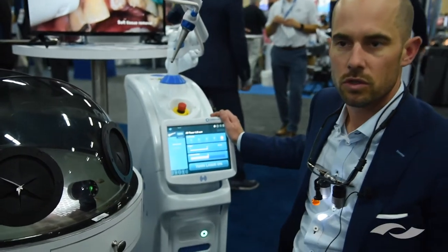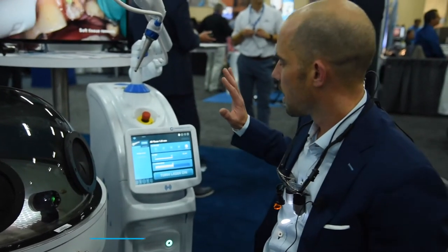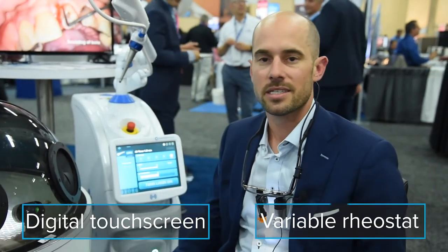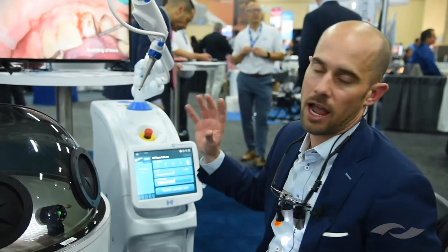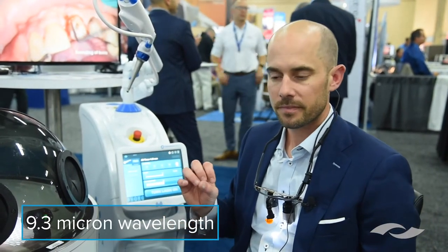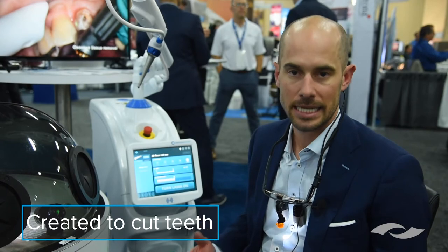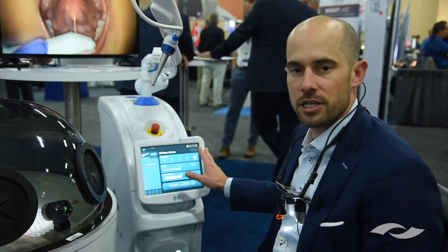The Solea laser is truly unique based on the physics of how it operates. It utilizes a digital touchscreen, a rheostat that's variable in pressure and intensity, and a handpiece that refracts and uses mirrors to control a beam. The reason Solea is so unique is that at its 9.3 micron wavelength, it is at the peak absorption for hydroxyapatite — meaning it is meant to cut teeth. As a general dentist wanting an all-tissue laser, it's the only all-tissue laser truly meant for dentistry. It truly becomes a tissue-selective laser.